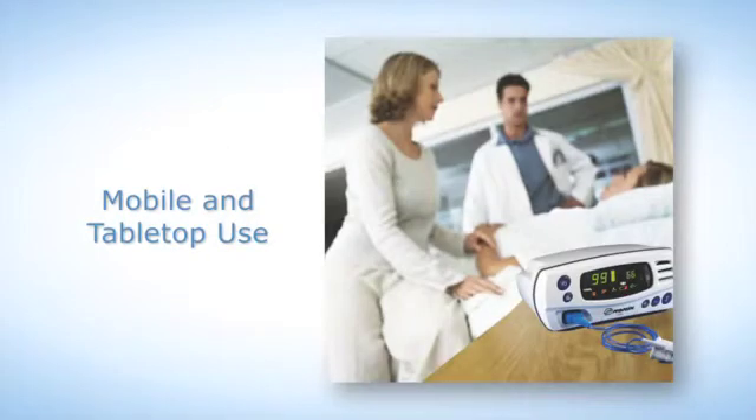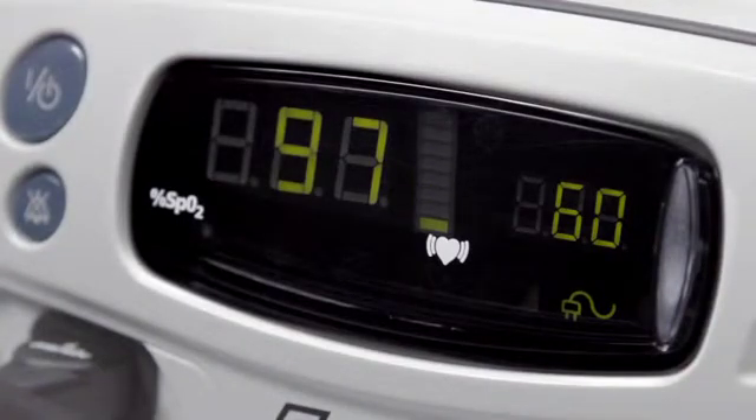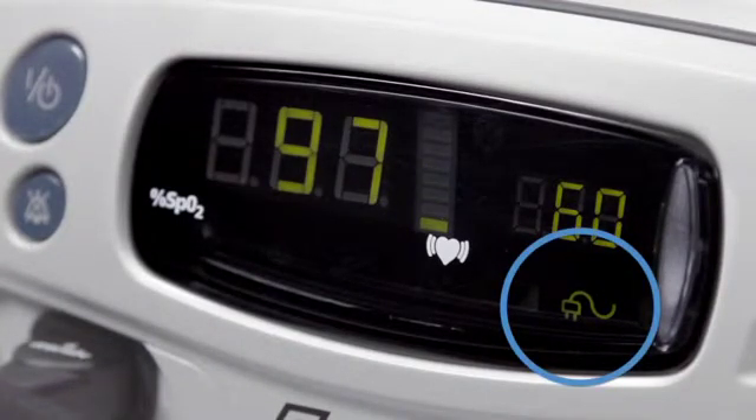This 7500 oximeter is suitable for both mobile and non-mobile tabletop uses. Both can be powered by 100 to 240 volt AC wall power. You will see a plug icon on the display when the oximeter is using external power.